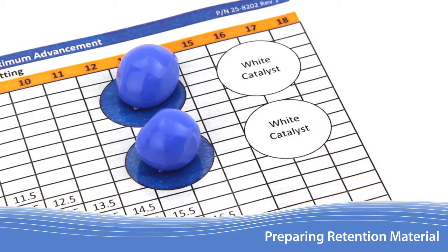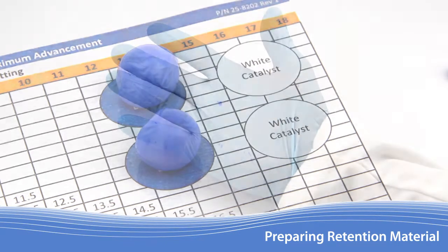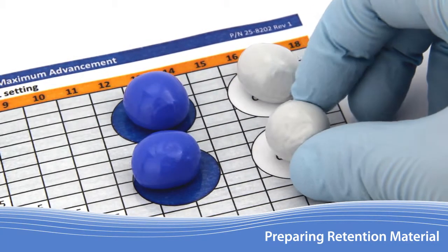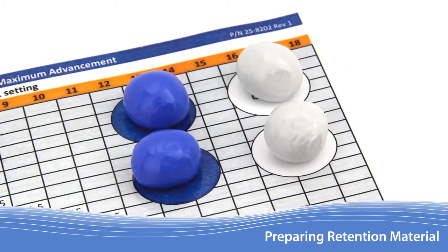Base should always be prepared prior to handling any catalyst, as residue may be deposited on the gloves which could prematurely activate the material. Now using the same process, prepare both amounts of catalyst on the work table.